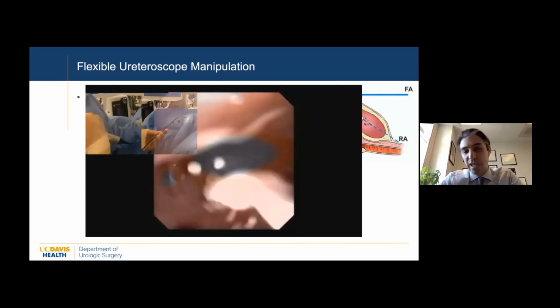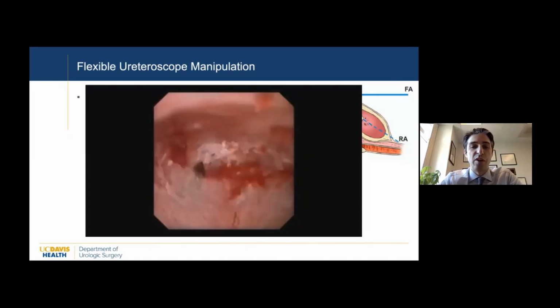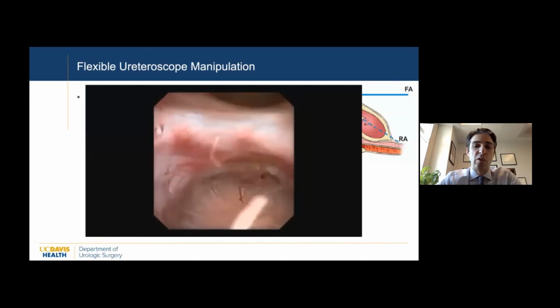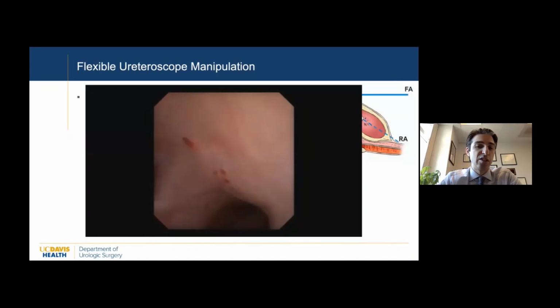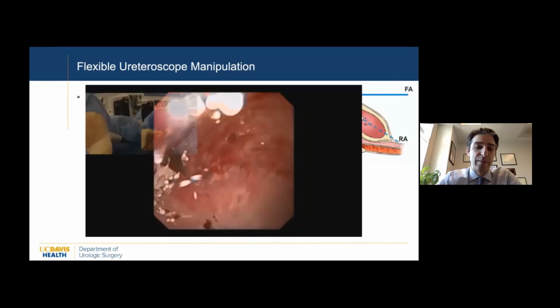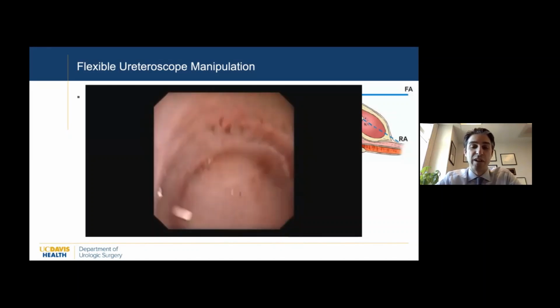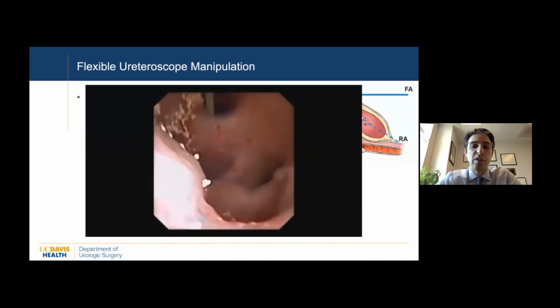As we rotate through the kidney, the goal is to try to keep the calyx in view as you're backing out so that you don't fall upon that infundibulum and your angle. And as we go down to the lower pole, all we're doing is rotating more and deflecting more. I think it's really helpful to think about this in this way, because sometimes you have a case that's a little bloodier, you can't see as well, and you have to kind of drive by feel. So I paused the video right here where you can see the angle of the kidney. Just that slight rotation to the left, again, to look right, puts the calyces in line.